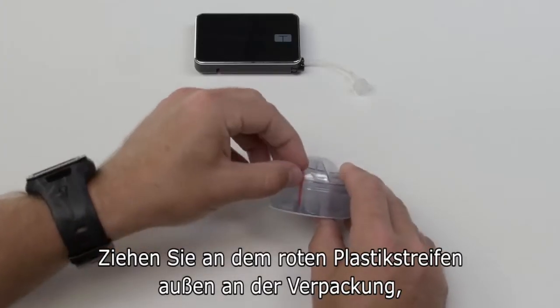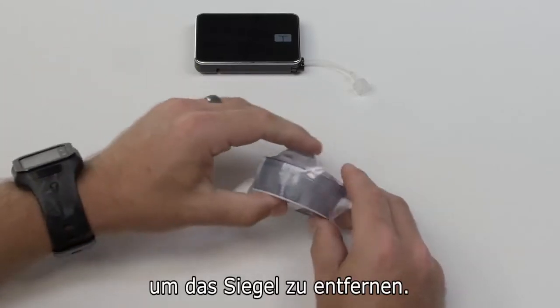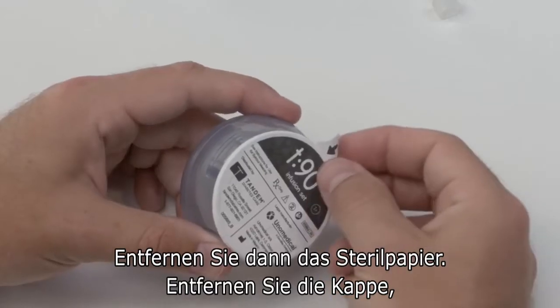To open it, find the red strip of plastic on the outer shrink wrap and pull it to remove the seal. Then remove the sterile paper cover.